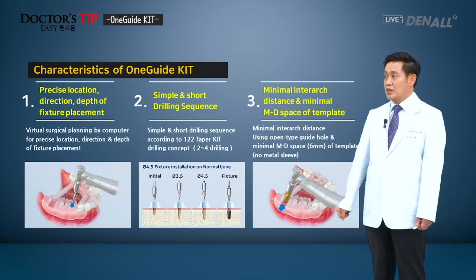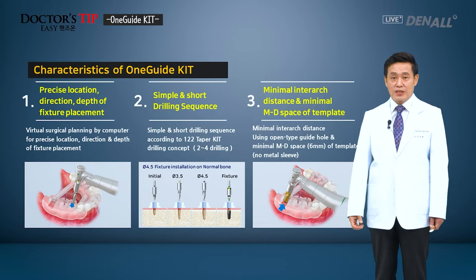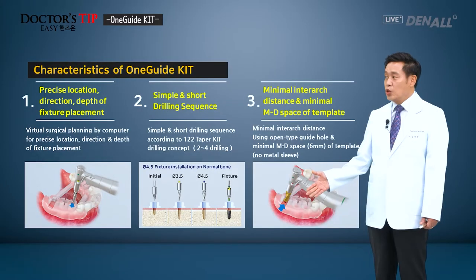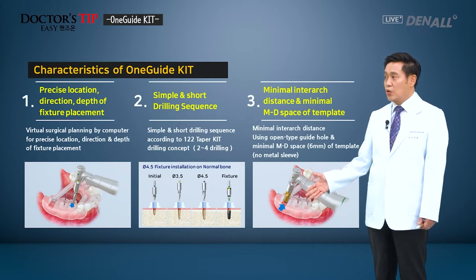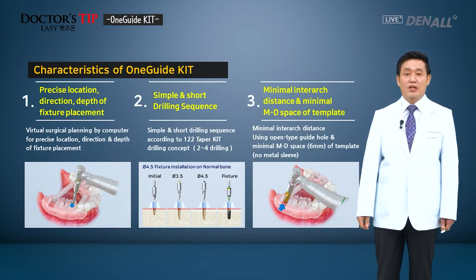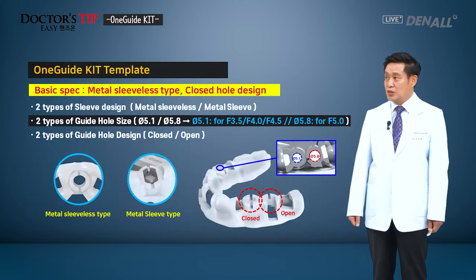Third, you can use this in minimal interarch distance. In other words, the OneGuide template is designed as a closed hole type, but depending on necessity, if the interarch distance is tight, you can create an open type guide hole. That's for a shorter interarch distance. In essence, it does not have a metal sleeve, so on the template itself, if in missing teeth areas the mesiodistal space is 6 millimeters, you can create one guide template. That's possible with this system.